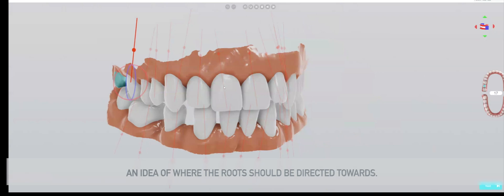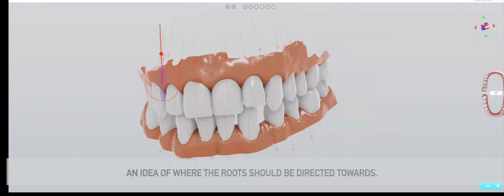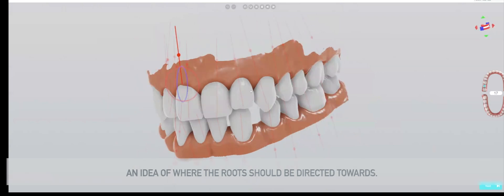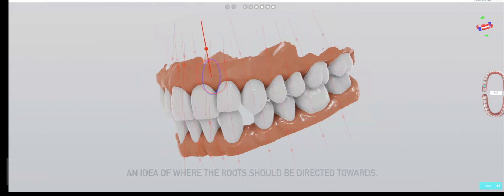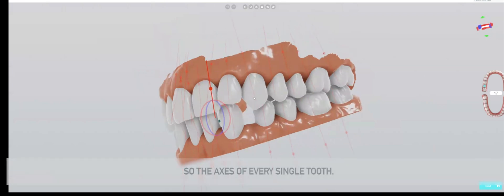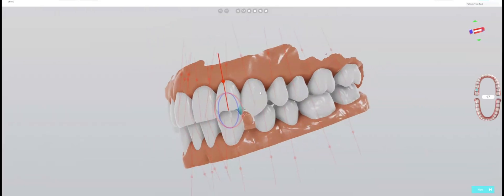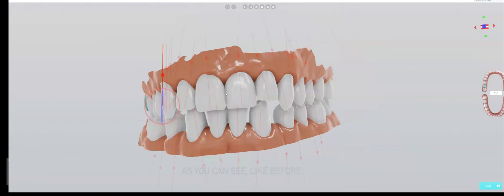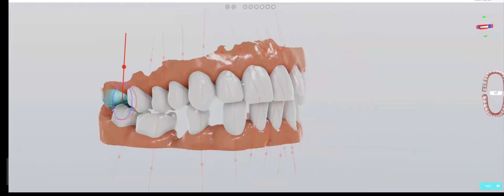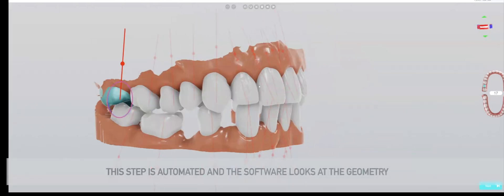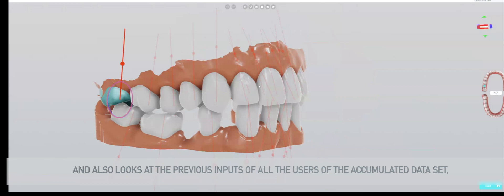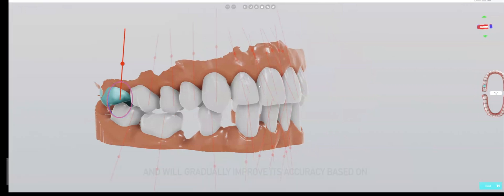So the axes of every single tooth, as you can see, like before, this step is automated. The software looks at the geometry and also looks at the previous inputs of all the users, the accumulated data set, and will gradually improve its accuracy based on how much data is provided and how much manual adjustment users make.